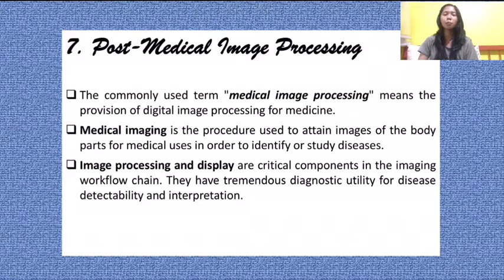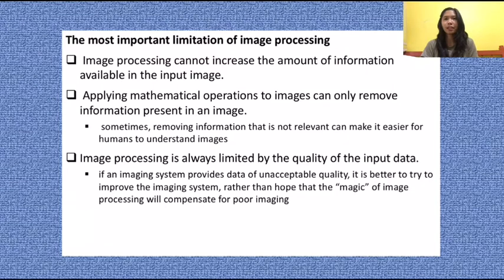In addition, the combination of information from two or more modalities can increase both sensitivity and specificity compared to a single exam. The most important limitation of image processing: image processing cannot increase the amount of information available in the input image. Applying mathematical operations to images can only remove information present in an image. Sometimes, removing information that is not relevant can make it easier for humans to understand images.